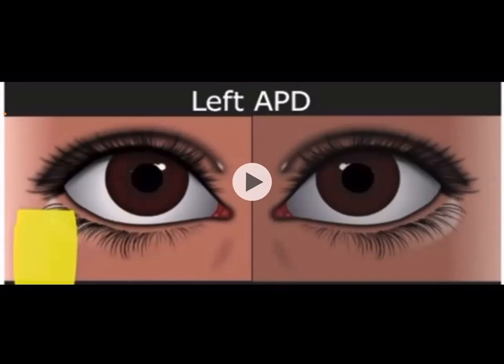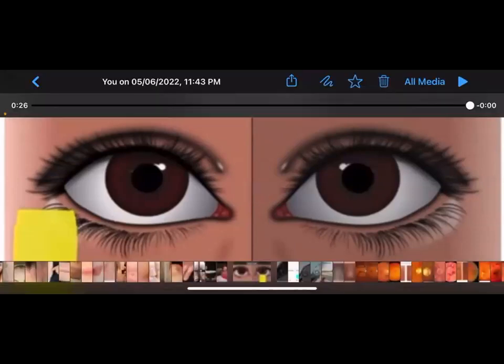Okay, the light source should be strong enough to be able to see clearly, but make sure that the light is not too strong, because if the light is too strong, it will reflect back from the retina. Okay, you will not be able to see clearly, especially the hard exudate, because it's yellow. Actually, it looks like glare. It looks as if the light is reflecting back from the retina to your eye.